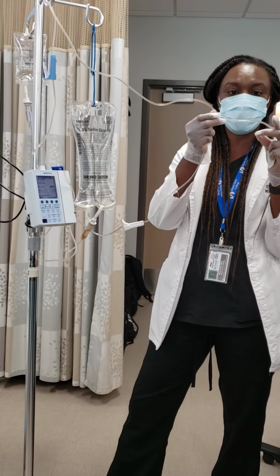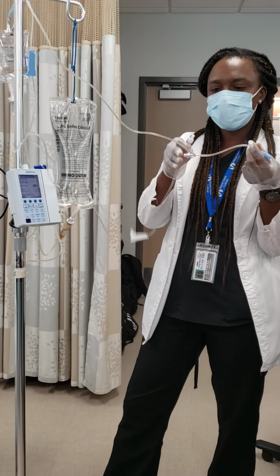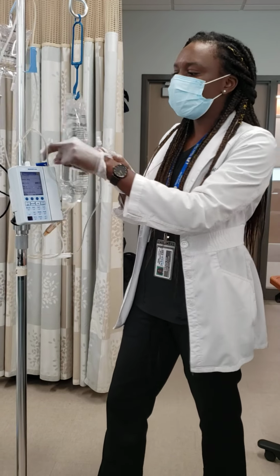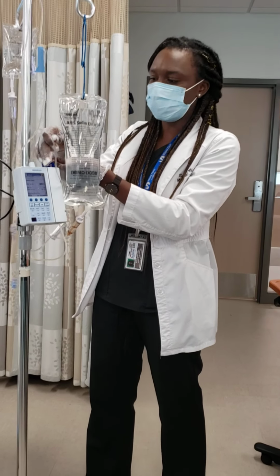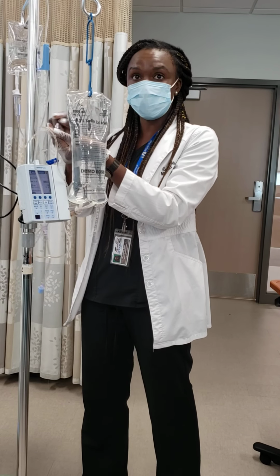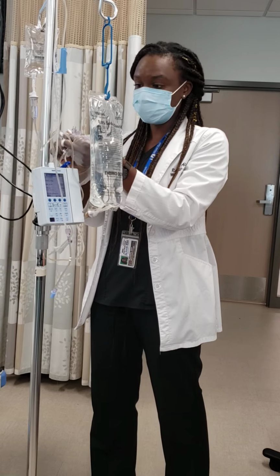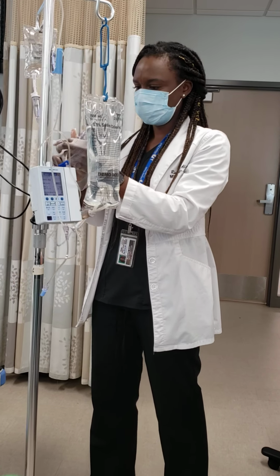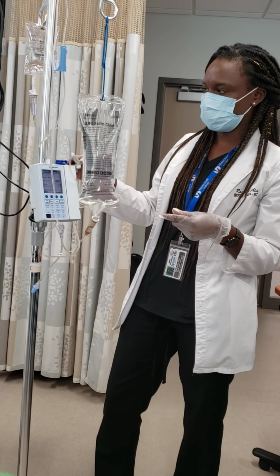So this is right here. So this is that. All right. So if you connect it here, it's just going to free flow, and your patient could possibly die. So you have to do it to where the pump can sense it, and it's going by what's programmed in the computer, in the pump, right? So of course you clean here because it's already exposed. After you clean it, it's clamped. You connect it, and after you do that, now you can open it up.